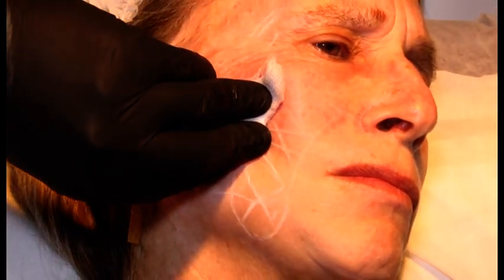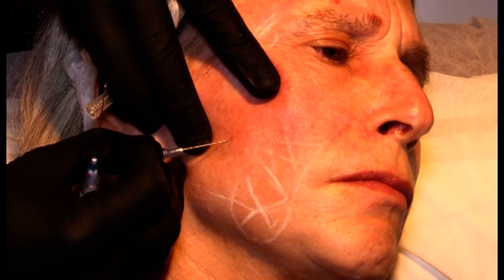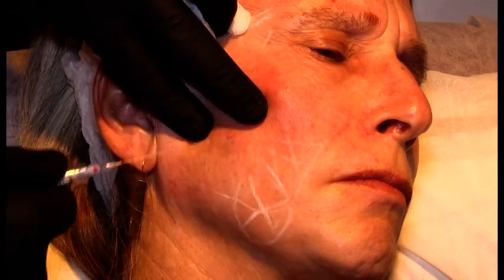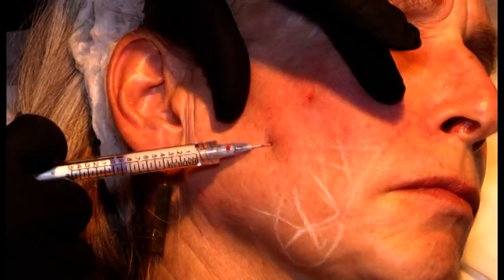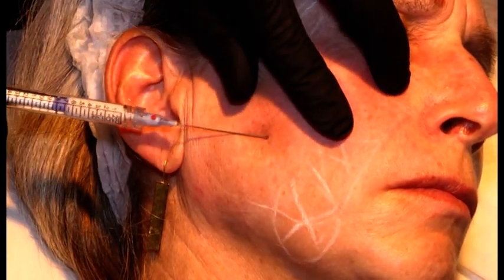Could I have a gray needle or a blue? All right, let's try. Thank you. So from here, I'm already halfway with my syringe.